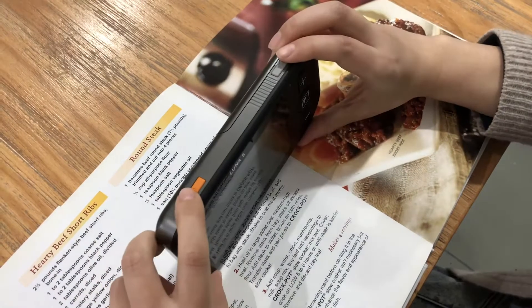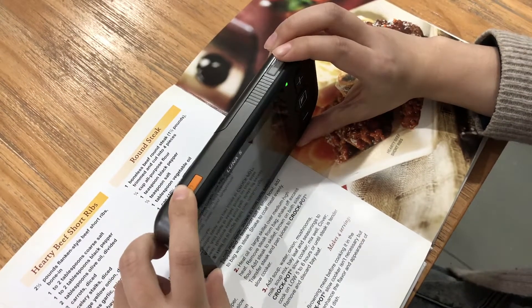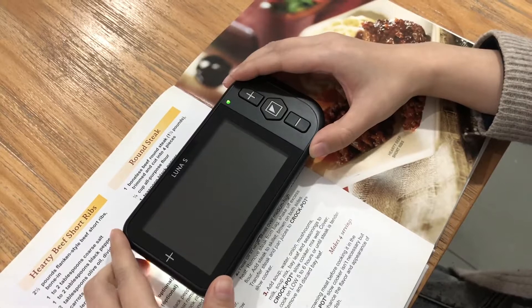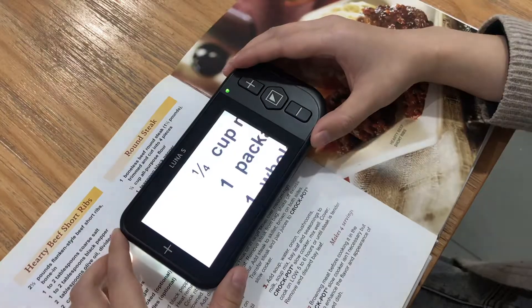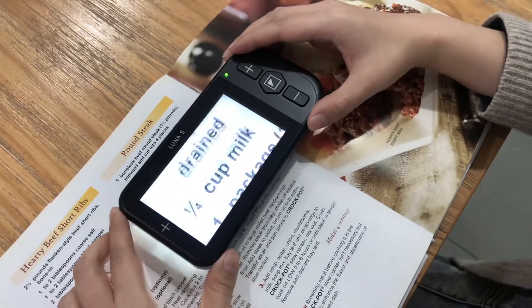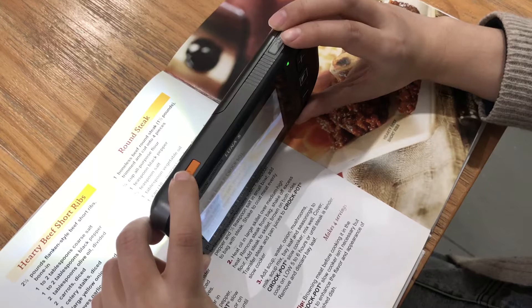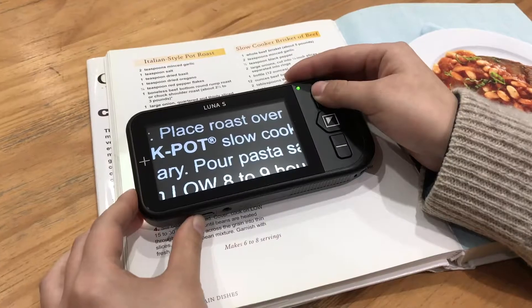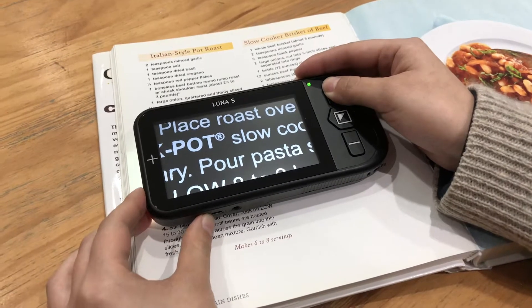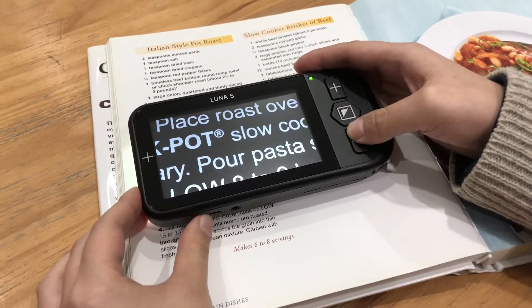Basic Functions. Press the power button to turn the device on. You can turn it off in the same way. Press the zoom in button and zoom out button to adjust the zoom.